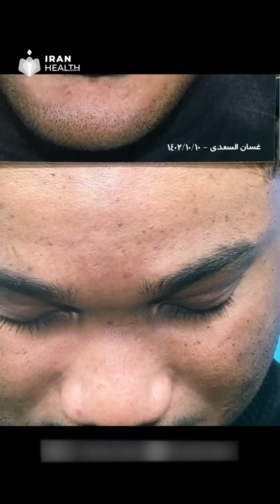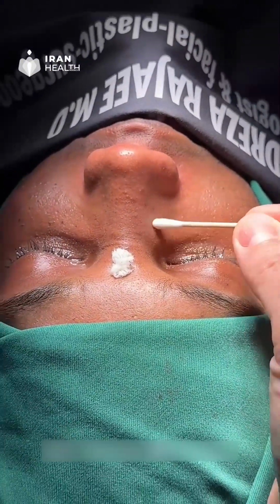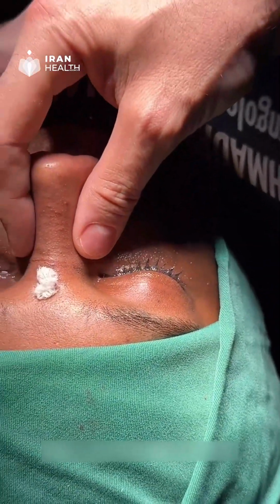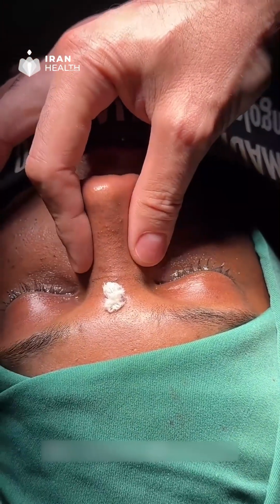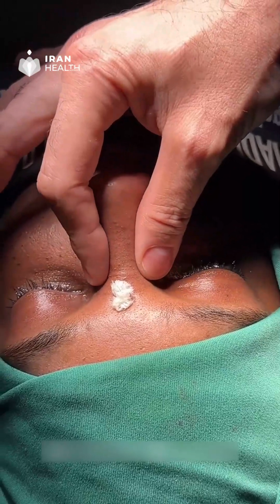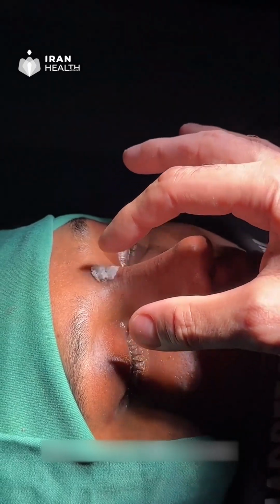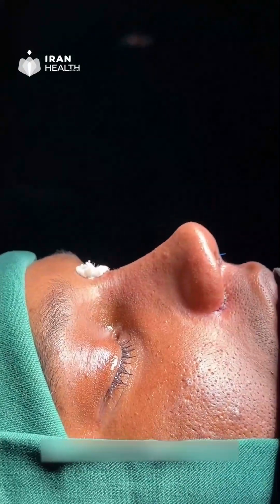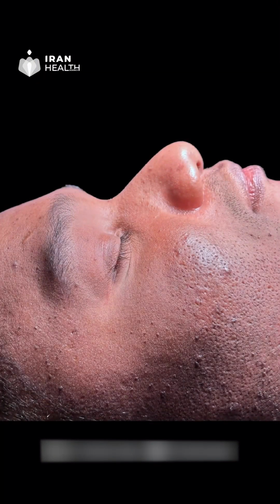Now, as evident here, we have performed the lateral osteotomy of the 2 sides. The skin flaps still have some width here, but if I touch it and squeeze it completely, we do see the real width of this bony pyramid. We've placed the diced cartilage and fascia fixated here by a bolster suture, recreating a gentle curve on the nasal dorsum, despite the fact that we had a very deep radix here.